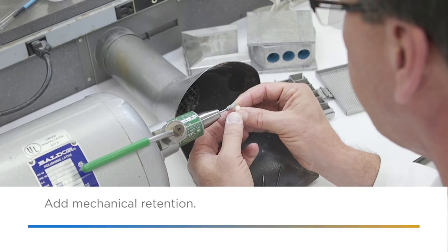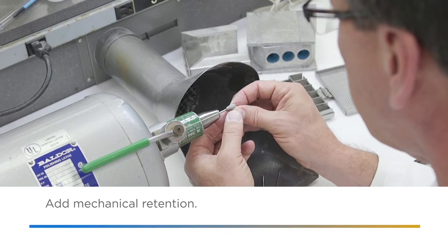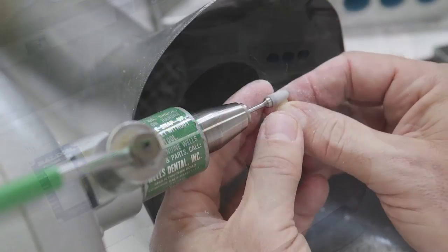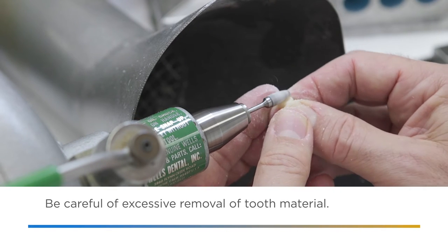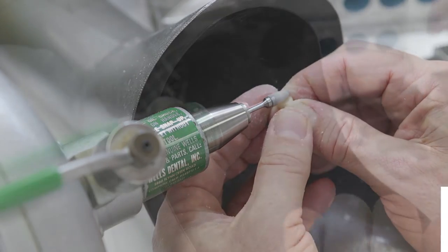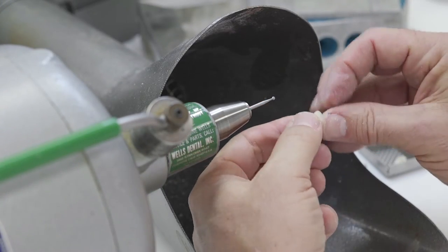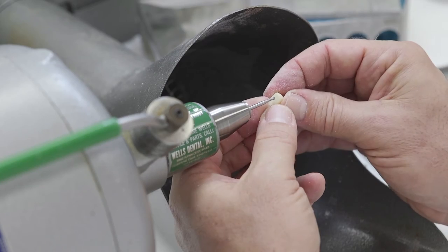Add mechanical retention to the teeth. Remove only enough tooth material to enhance retention. Using a number 4 round burr, cut diatorics in teeth as shown. Excessive removal of tooth material will weaken the tooth and may lead to fracture.